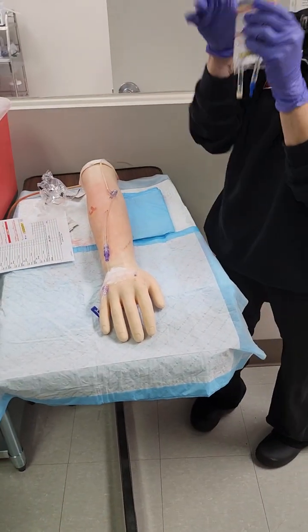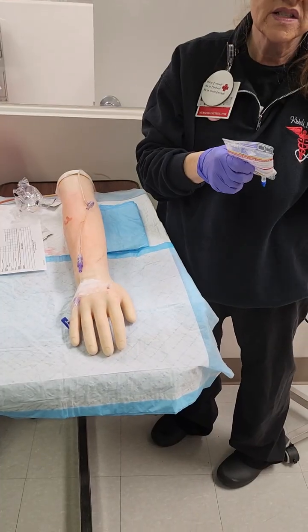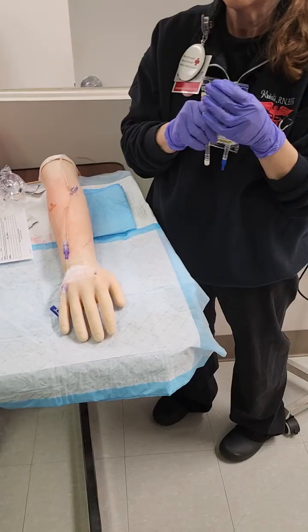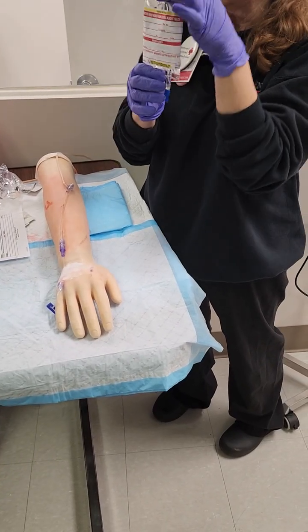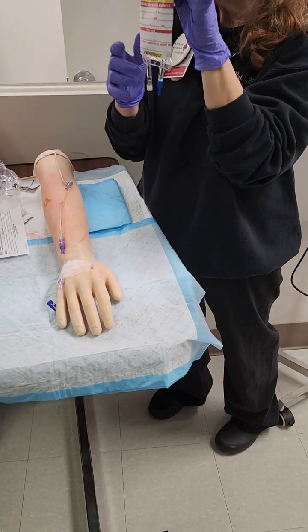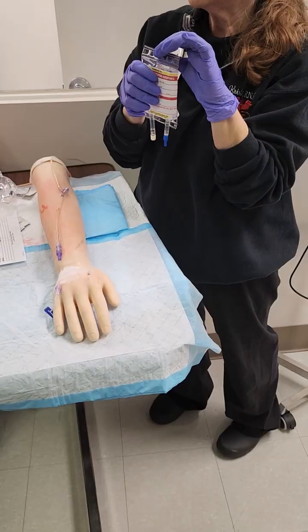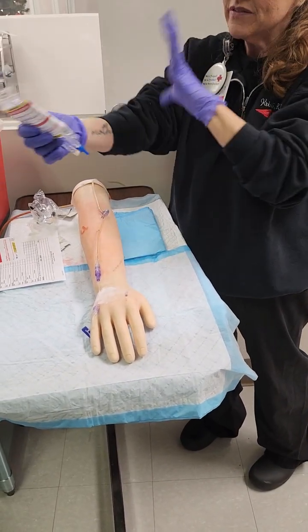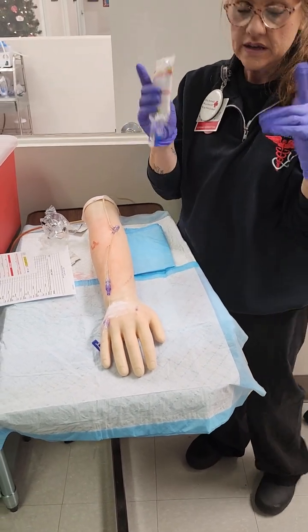So I have 100 milliliters in this bag that I need to infuse over an hour. So what am I going to set my pump for? How do I do that? You need to divide the volume by time. So what's my volume? The 100 milliliters divided by 1 hour. So what is that? 100 divided by 1 is 100. That's okay, you'll have a calculator. So I'm going to set my pump for 100 milliliters an hour.